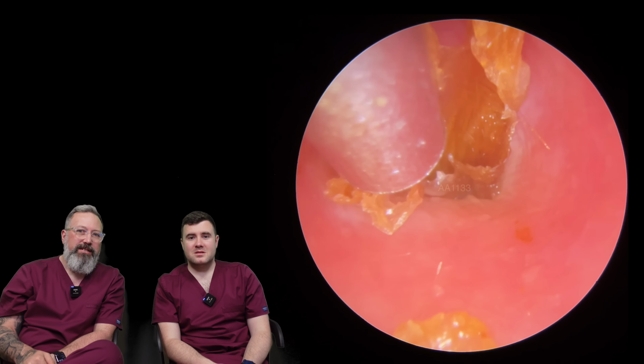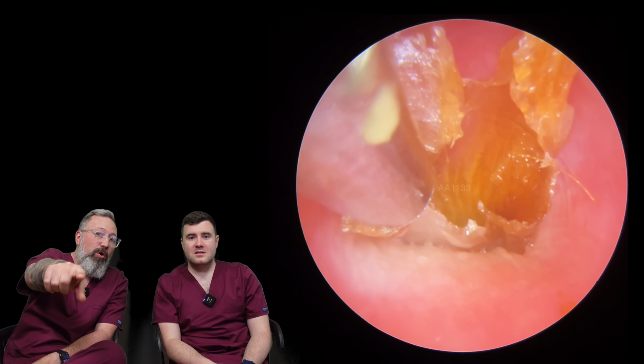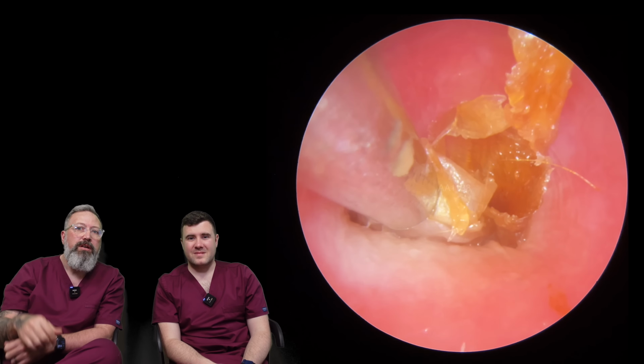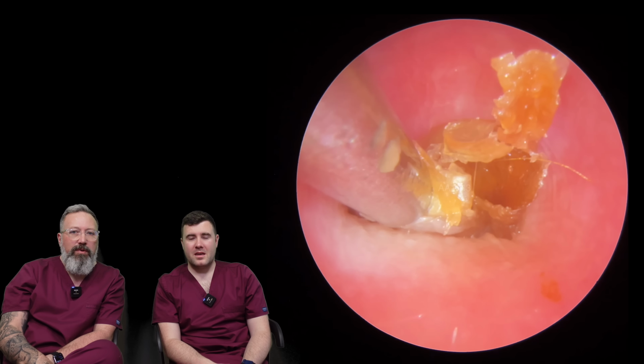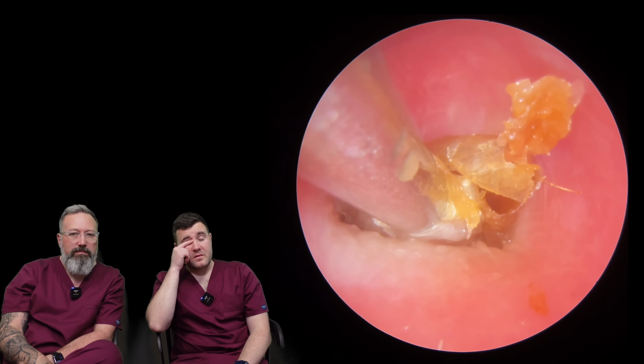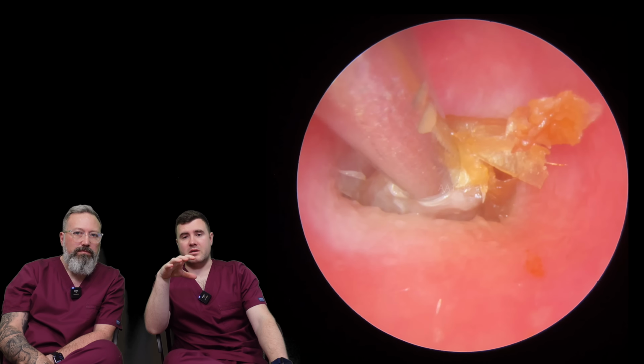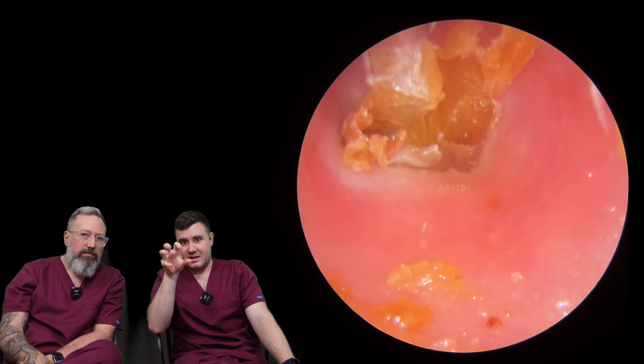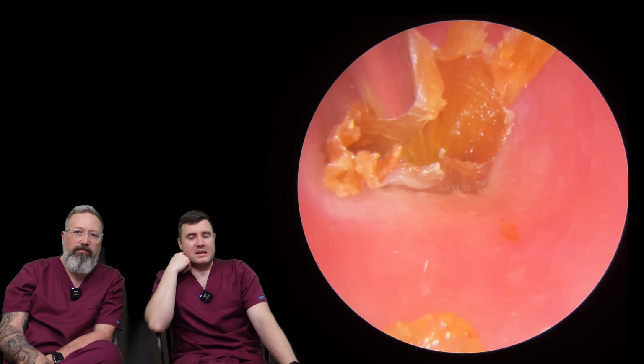But you can really see that layer. As soon as you let it go, it all naturally wants to fold back into its original position. Yeah, always difficult ones. And we've naturally got a bit of a flinch from the patient there. That's obviously where it started to pull a little bit.